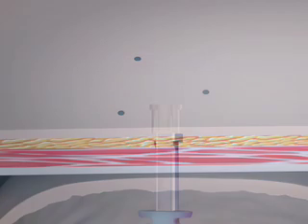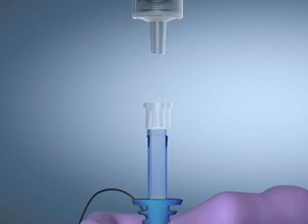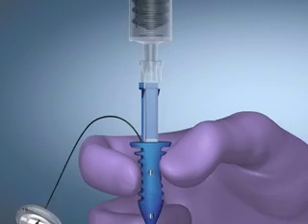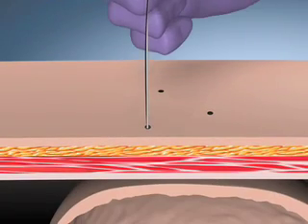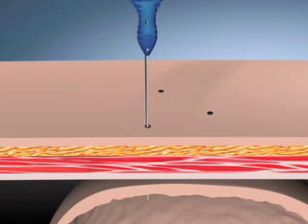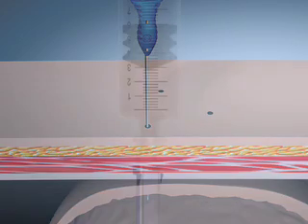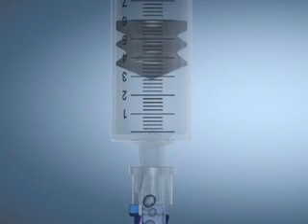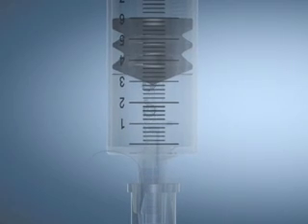Attach a Luer slip syringe containing 1 to 3 milliliters of sterile water or saline to the needle hub. Under fluoroscopic guidance, insert the preloaded safety pexy slotted needle with a single sharp thrust through one of the marked corners of the triangle until it is within the gastric lumen. The simultaneous return of air into the syringe and fluoroscopic visualization confirms correct intragastric position.